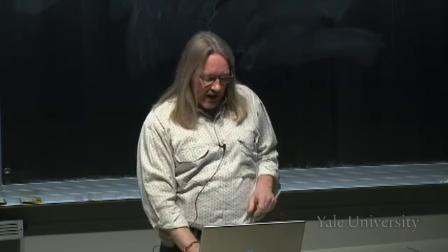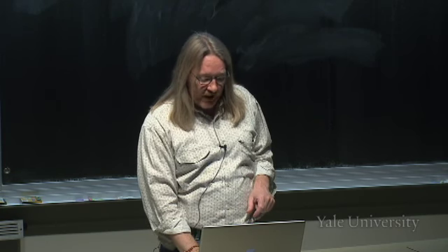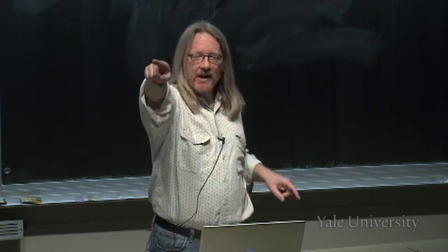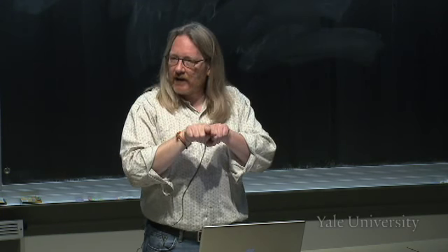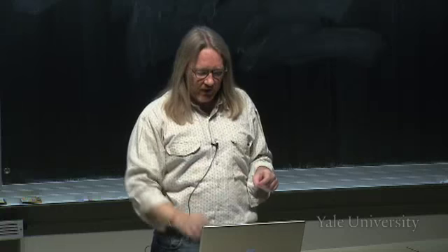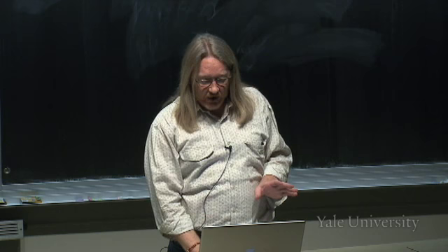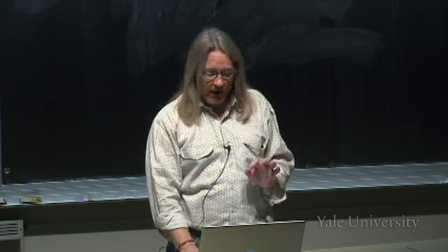And so if I have a positron-emitting substance in the brain, it will emit gamma rays, which can be detected. Because I'm detecting one here and one here, I know exactly where the source came from. I can trace it back along the lines where I detected the gamma rays, and I can find out where the positron emitting element was. And so I can make very nice maps of the brain like these that show you where the positron emitting isotope accumulates in the brain. And this is called PET imaging.